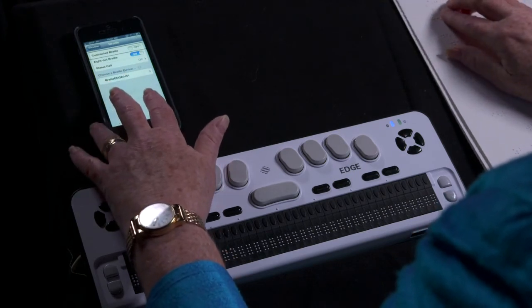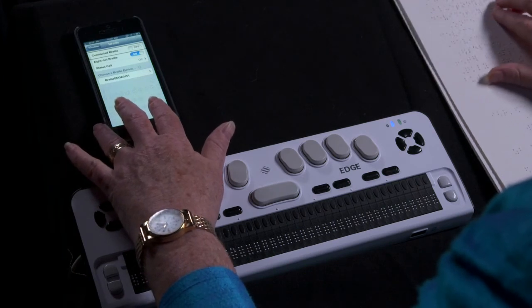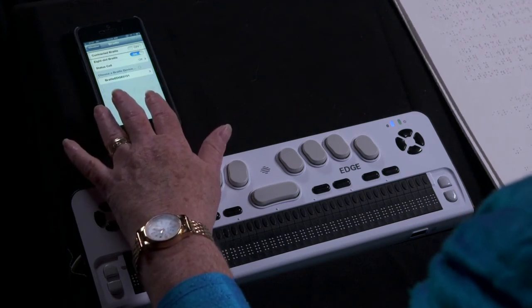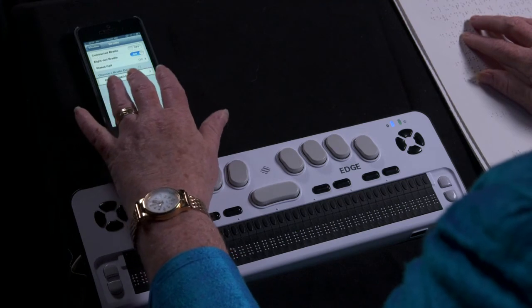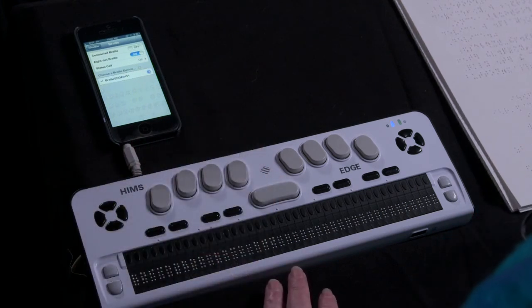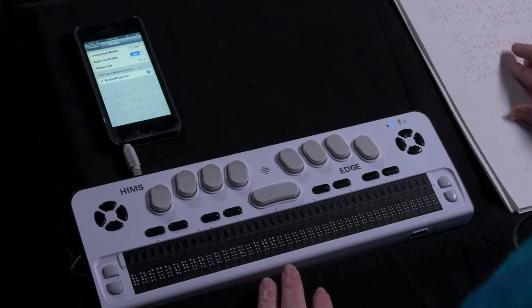If Bluetooth has not been activated on the iOS device, you will be prompted to do so here. Once Bluetooth is activated, the name of your device will display under the heading 'Choose a Braille Device.' The device shown is BrailleEdge 0151, listed as Not Paired. Select the display's name and you will be prompted to enter the display's four-digit pairing code.